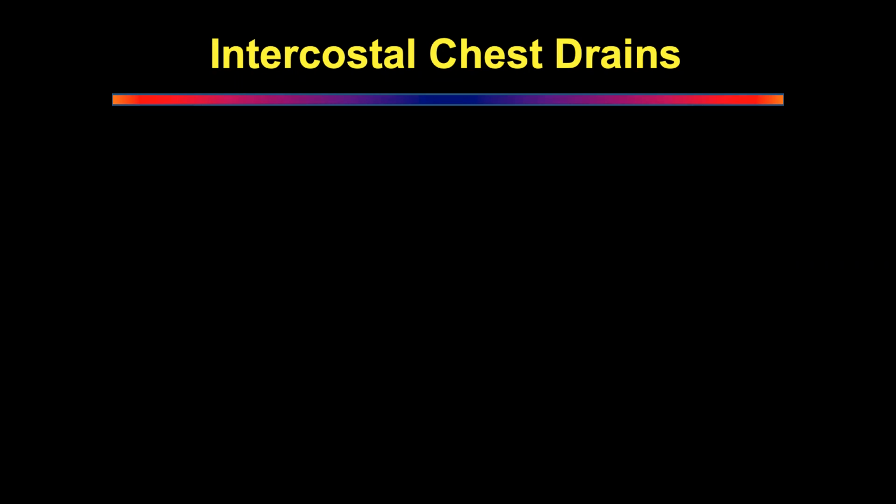That's later. At the moment, we're just doing basics. Okay, what are the types of chest drains that you know? Straight, right angle. One is straight, one is curved. Right angle, very good. With trocar, without trocar. What's the problem with trocar? With trocar, there is more chance of injury to the underlying structures, lung and vessels.